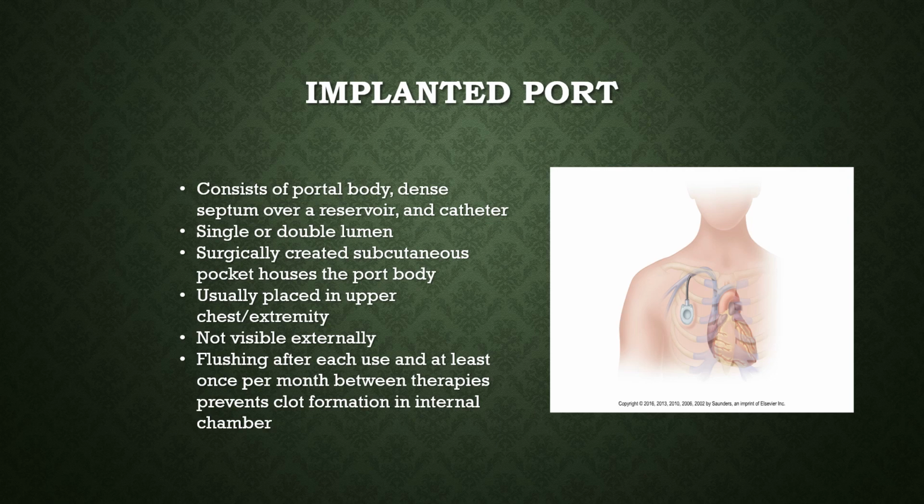It's surgically implanted, and then the patient can get their medication through it, and I'll tell you how in just a minute. I'm going to back up just a minute, and I can't back the slide up, it will erase what I've recorded. But on the slide where it showed multiple lumens of a central line, the advantage of a central line is that with a regular IV you've got one tubing, whereas on a central line you've got 1, 2, or 3 little pigtails coming off of it. So you've got 3 different ports there. You can maybe put blood in one port, draw labs out of one port, and give your fluids in one port. So it gives you a lot of flexibility with those central lines.